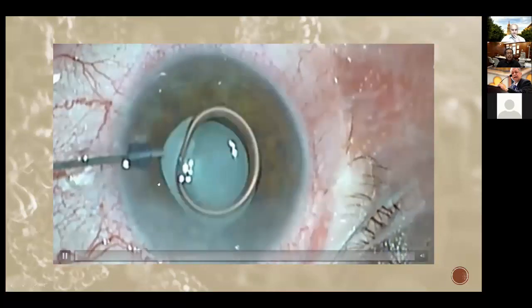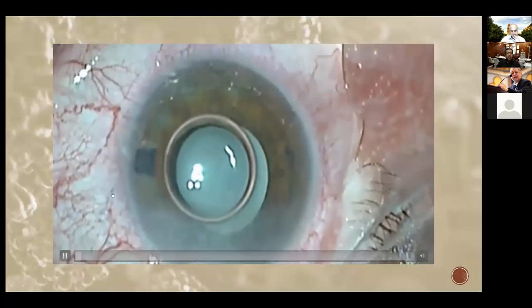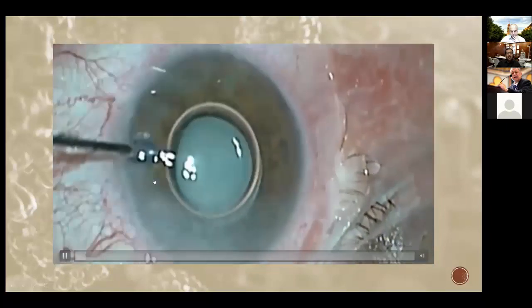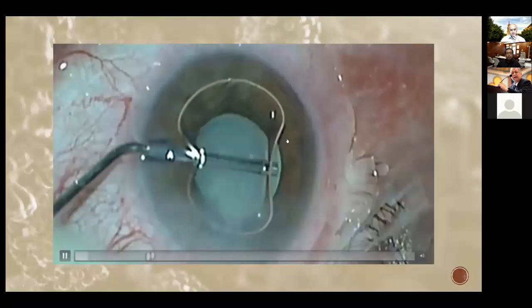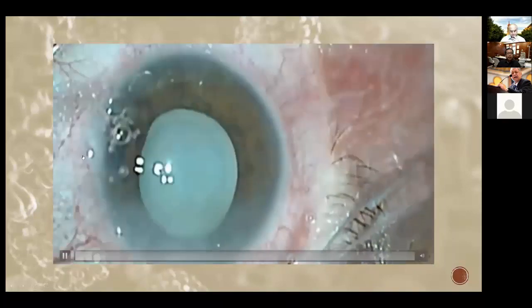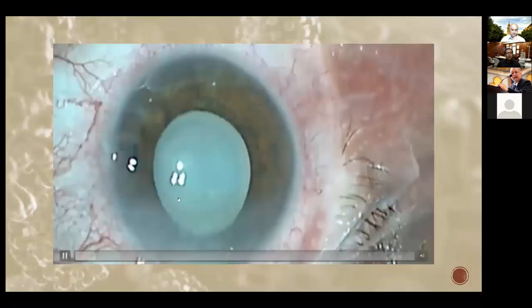In this case, as you can see, I still will do my rhexis from the side port, as I always do. The trick here when I'm injecting my viscoelastic is that I have to go to the other side and inject the viscoelastic to make sure that the anterior chamber is fully filled with viscoelastic and every single part of the aqueous has left the anterior chamber. Now I'm going to start with my rhexis.